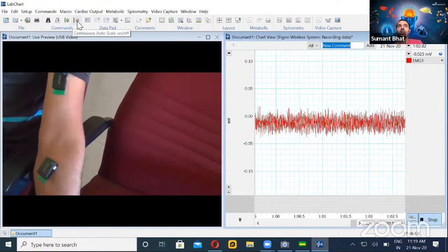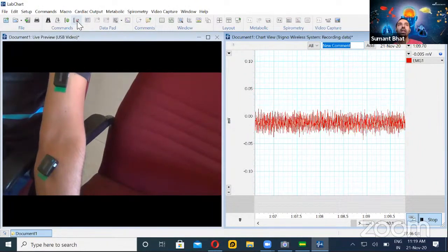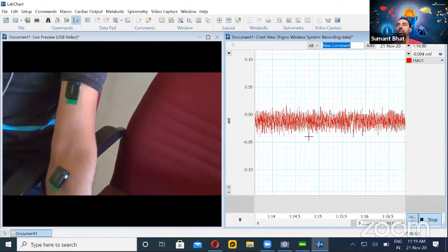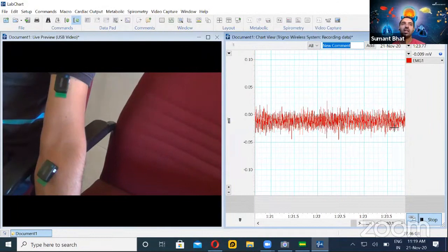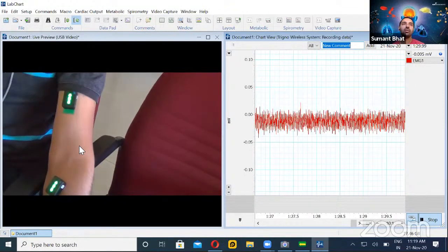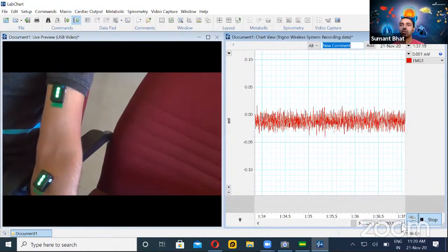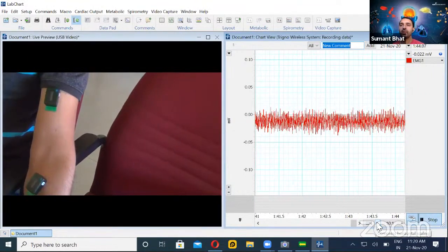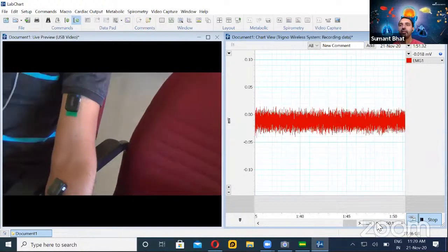There is also an automated icon which will scale up continuously. It is better during recording to keep it checked, so that as the waveform changes, you can automatically see the signal amplitude scaling up to the height of the window. Now we are just monitoring the resting EMG — sir has put the arm at rest and you can see some baseline activity.